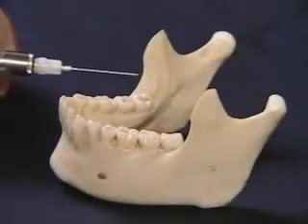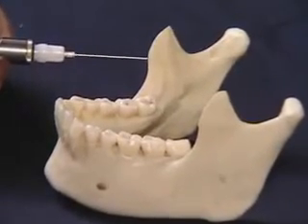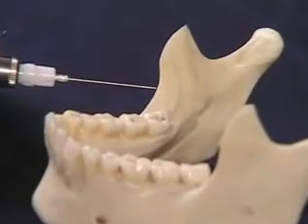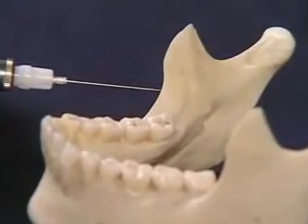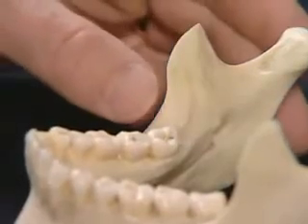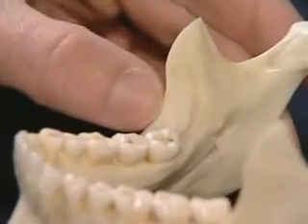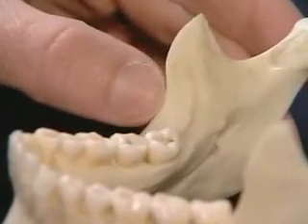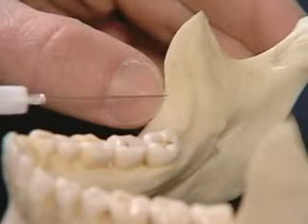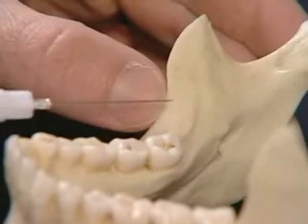You begin by looking at the anterior border of the ramus and feeling the greatest depth, which is the coronoid notch of the external oblique ridge. This point should be palpated with your thumb or finger and the greatest depth noted, because that will correspond to the height of injection, which is usually between the midpoint to the height of your fingernail.